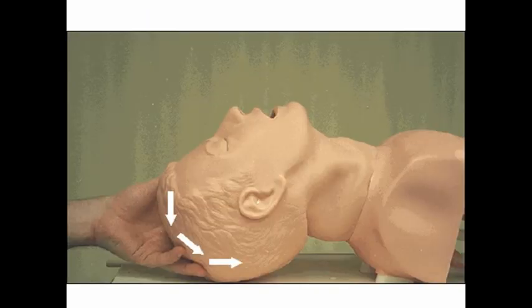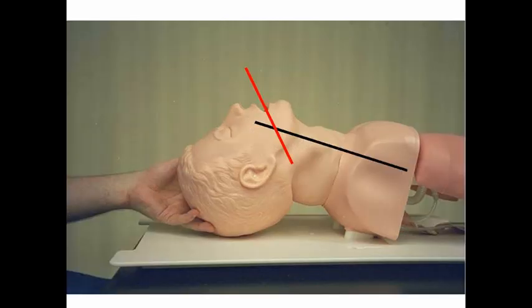And more details of these maneuvers are going to be shown in the following videos. When the chin lift and head extension maneuvers are performed properly, we see the oral and laryngeal axes coming more into line. They become collinear. They are not quite lined up, but they're getting closer.